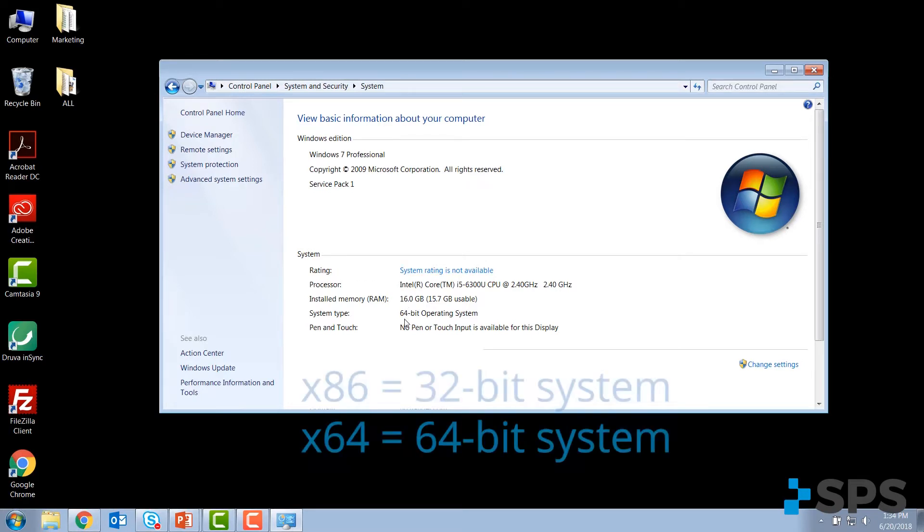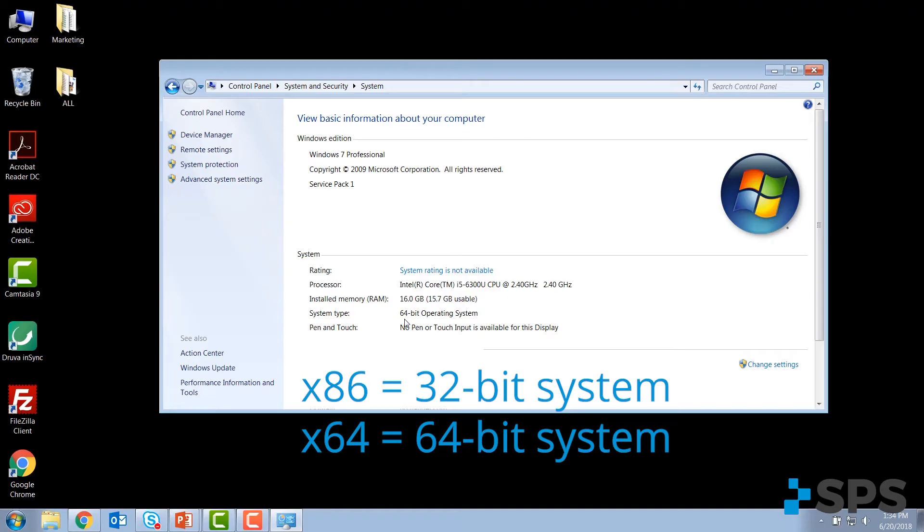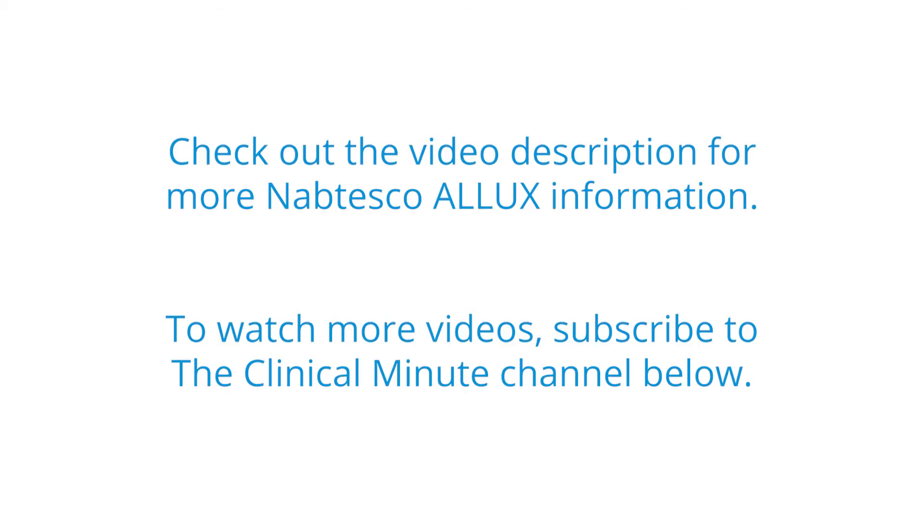When you go to load the drivers, x86 would be the file for a 32-bit system, x64 would be the selection for the 64-bit system.